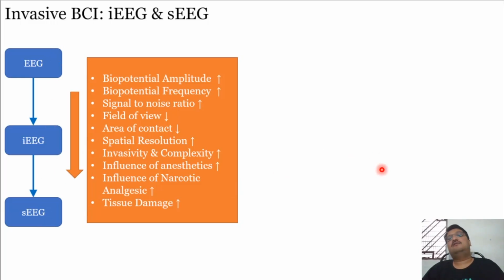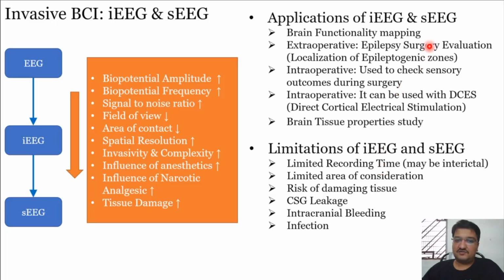So now let's quickly see what the applications and limitations of invasive EEG techniques are. First and foremost, brain functionality mapping.